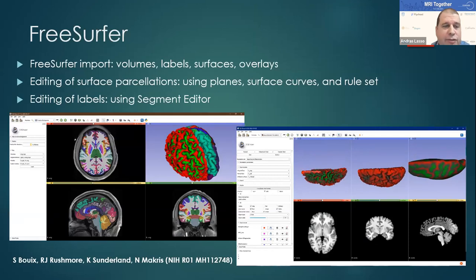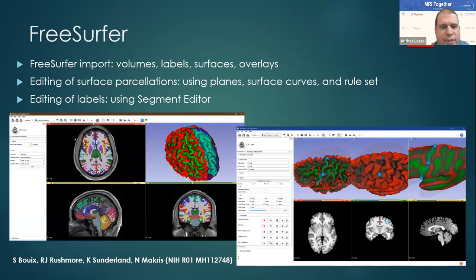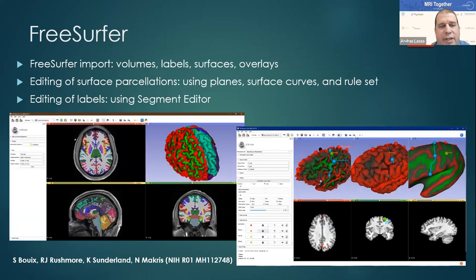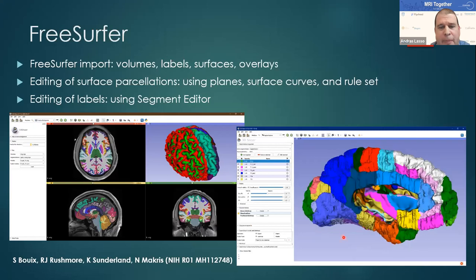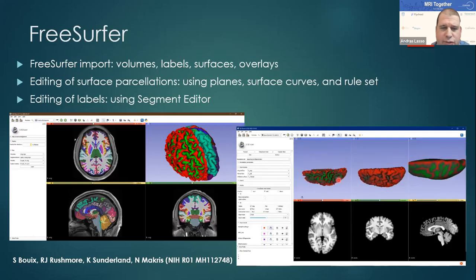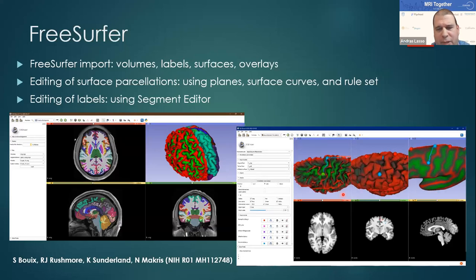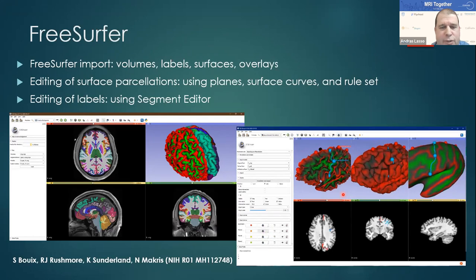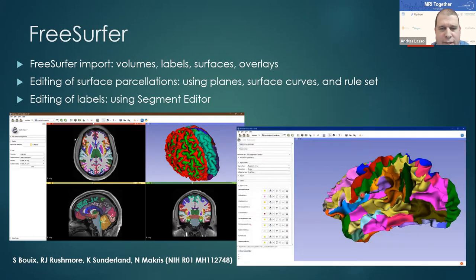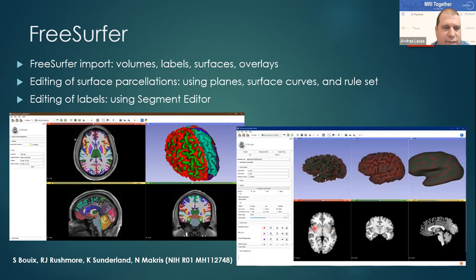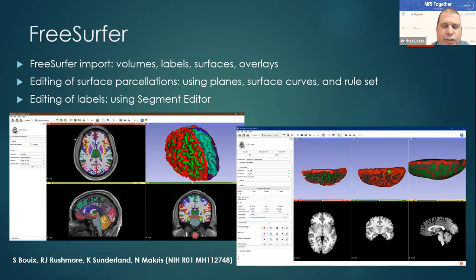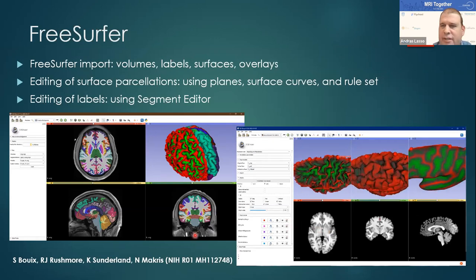We also added FreeSurfer support many years ago, so you can load volumes, labels, surfaces, and overlays. Recently we added the capability to also edit this — you can edit surface parcellations by defining surface curves. From multiple curves and planes and a set of rules, Slicer can put together a complete parcellation. This is useful when you need to edit or refine existing parcellations, and you can also edit labels using the segmentation editor.